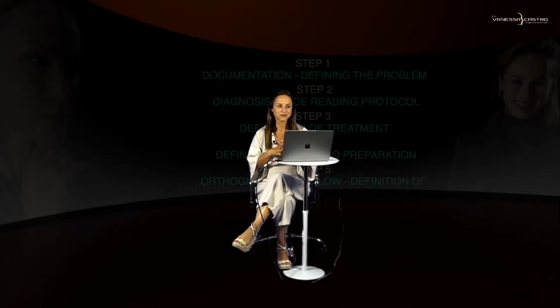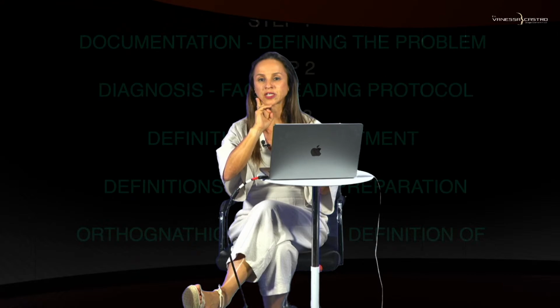Priscila Gonçalves, thank you for your question. Do I use the same fixation protocol in the cases? I changed it, Priscila. This case that I just showed you is a 10-year-old case, and today I use just an L plate in the mandible and 2 bicortical screws on the back, and an L plate on the front, on the sagittal osteotomy. I don't use 2 straight plates on the mandible anymore.